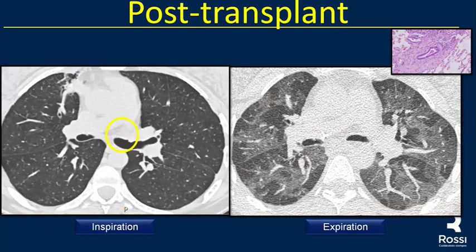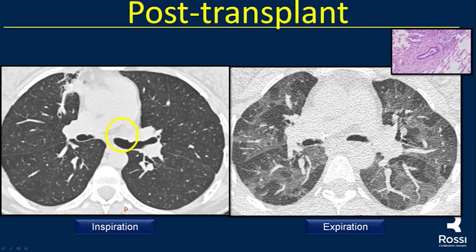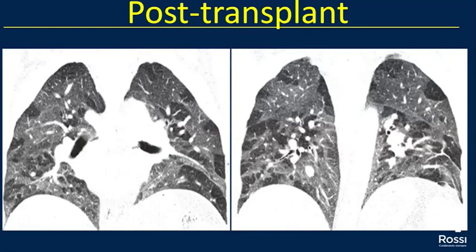This is a post-lung transplant patient who presented to her pulmonologist with reduced FEV1 on functional studies. An inspiratory and expiratory CT was performed. The inspiratory CT shows subtle areas of mosaic attenuation. The expiratory CT reveals areas of air trapping and normal lung due to chronic post-transplant rejection. A coronal view confirms air trapping in both lungs.